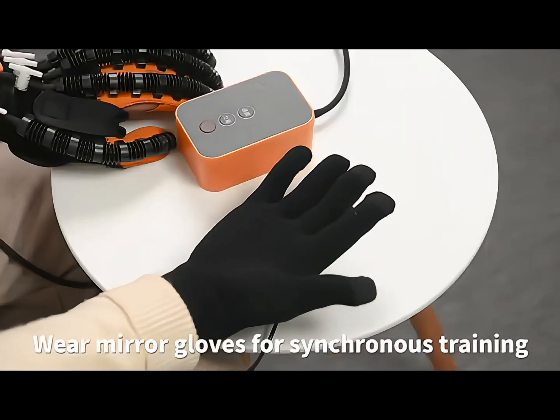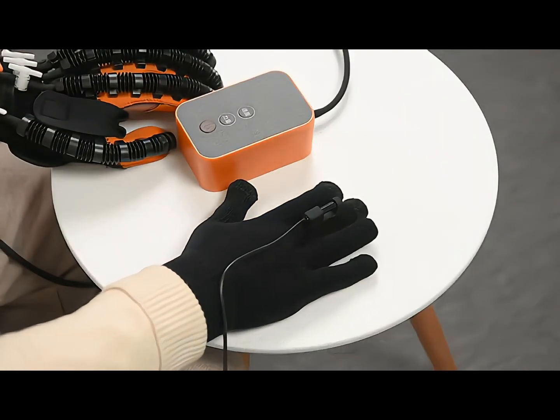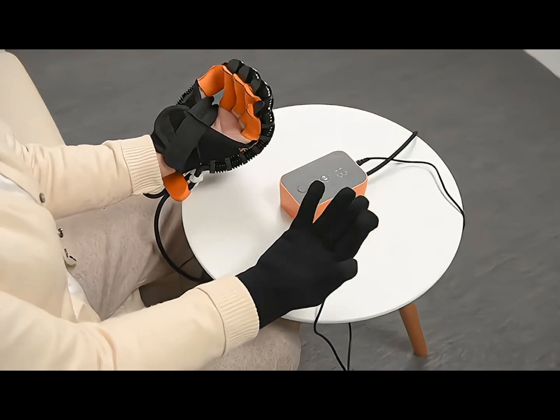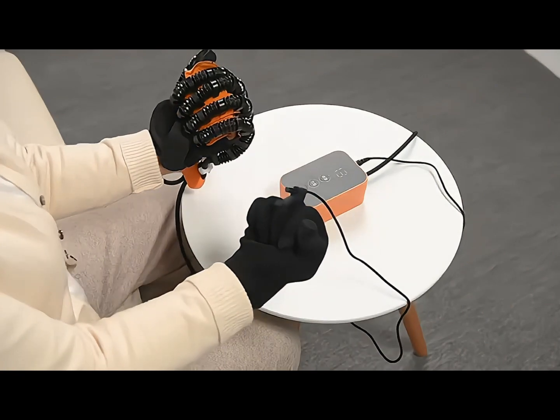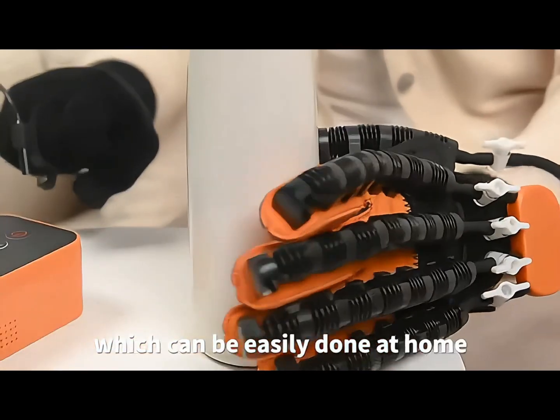Wear mirror gloves for synchronous training, which can be easily done at home.